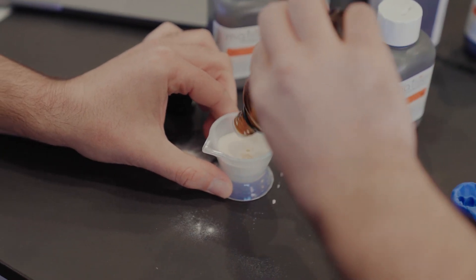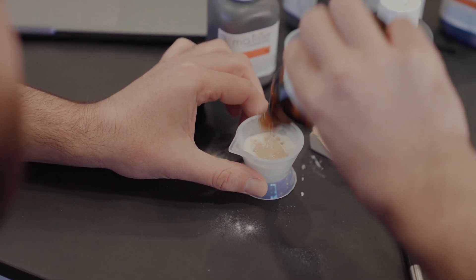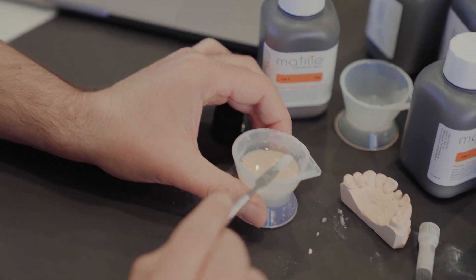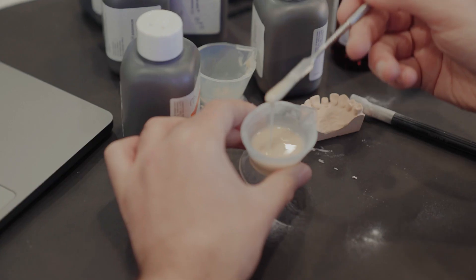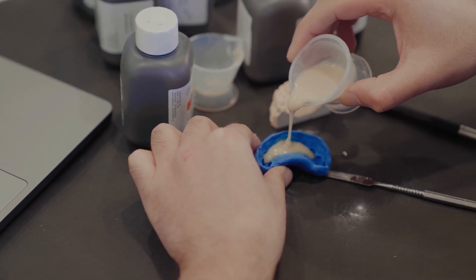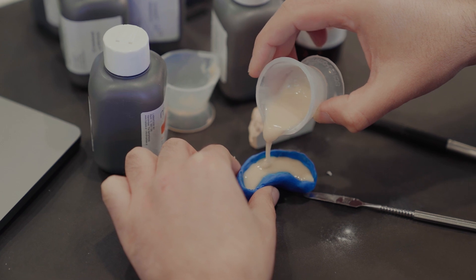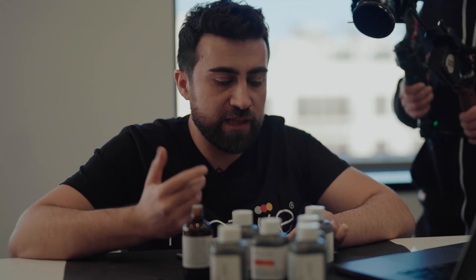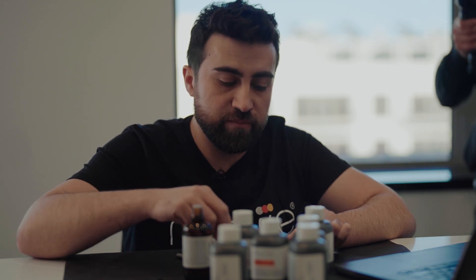We add liquid to the mixture. A quick way to check if the liquid amount is correct: it should be higher than the powder level. Then you mix it. This is the perfect consistency, and then you basically pour this into your model. So this is it — you have a very nice precise model in maximum 15 minutes.